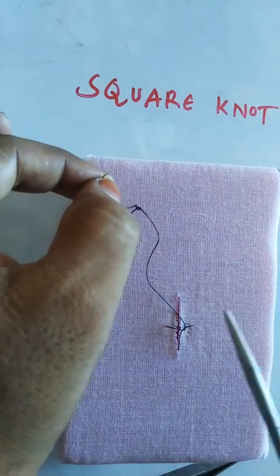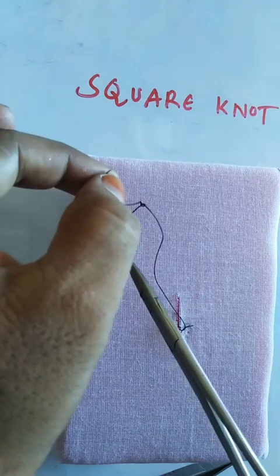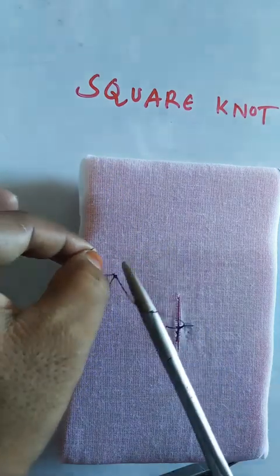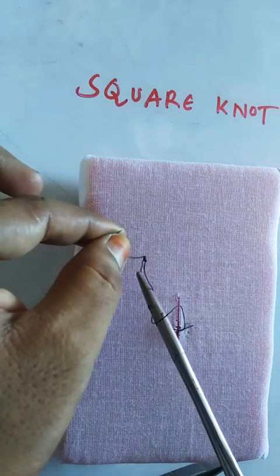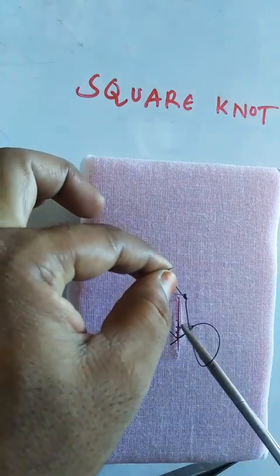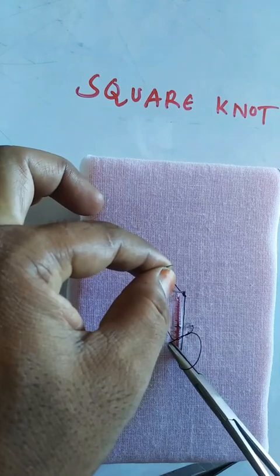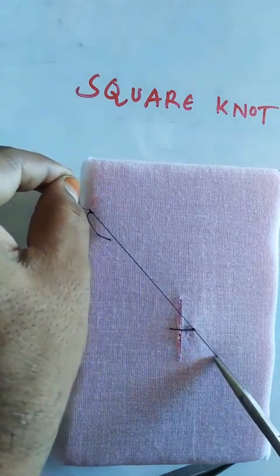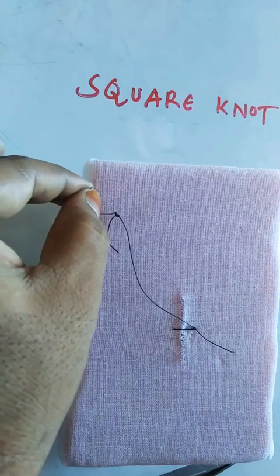Again I will form a loop in anti-clockwise direction, and again I have to hold that. This is your second tie.